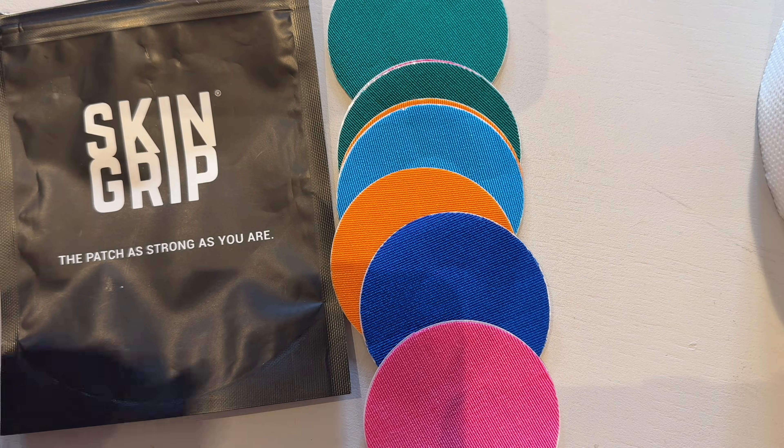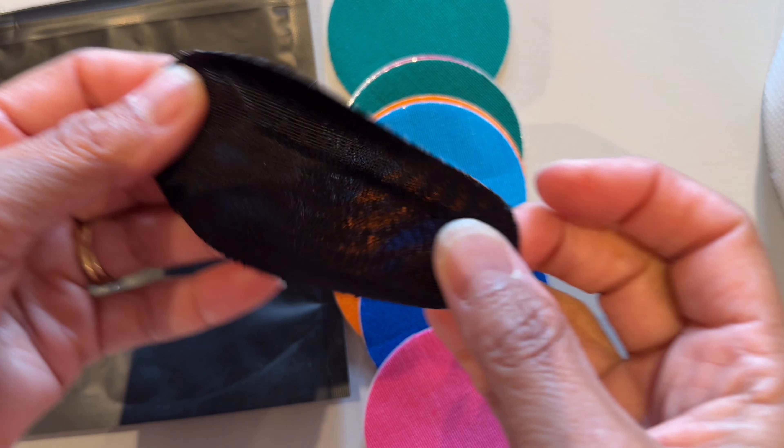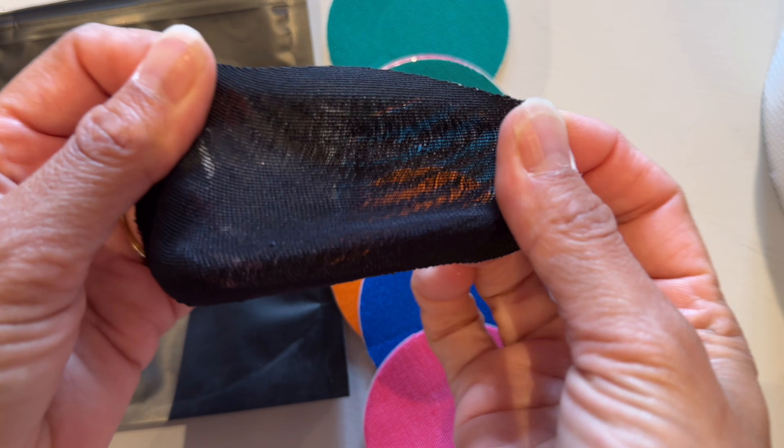I have not had this issue with Libre, but I've had it with another CGM — the Dexcom G7 — where I managed to twist it off even past the overlay tape in my sleep. My solution has been to apply a skin grip overlay tape without a cutout, and as I said I've had no problems with the Freestyle Libre.